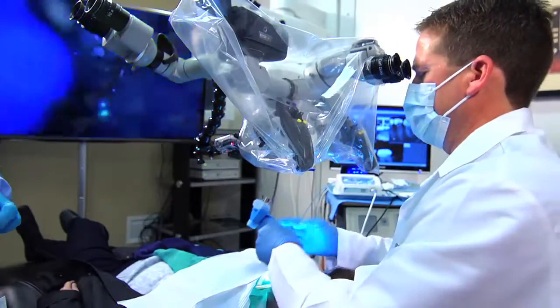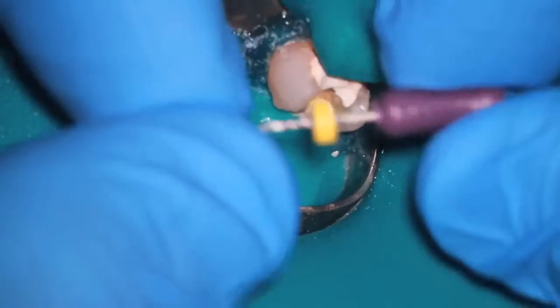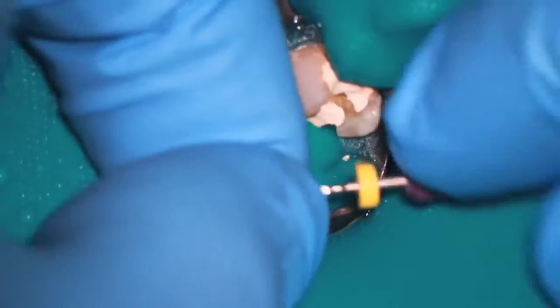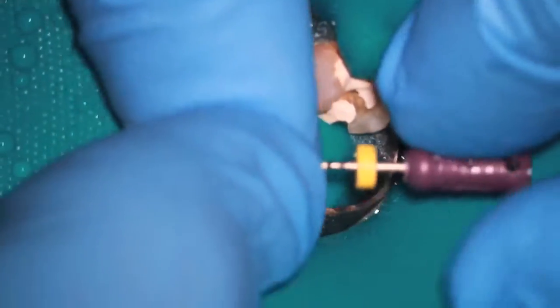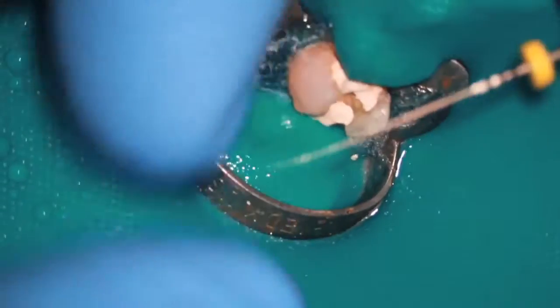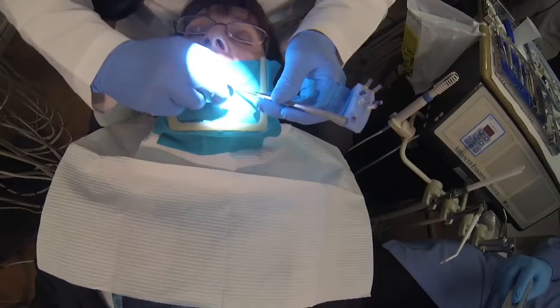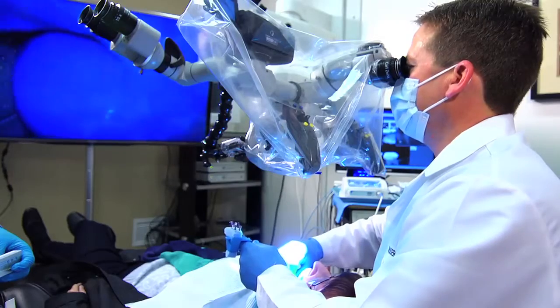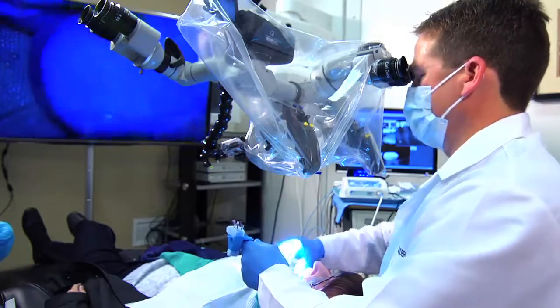After opening up my coronal segment, I'm going to follow the rules that we all know from Ibarra, and what I'm going to do is just go for an estimated working length of approximately 21 millimeters. Here's my indicator on my stopper, so I'm going to very gently now just give it a little sweeping curve. So now I'm going to enter into the canal. My main sweep so far, I've been able to detect going in a distal direction.